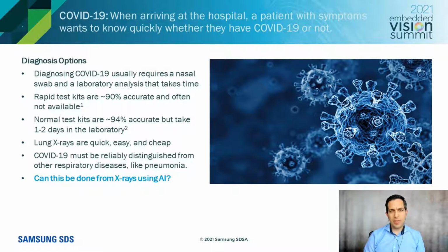And so the question is, can we, in an acute patient, detect COVID based on a lung X-ray? And of course, the answer is yes, otherwise I wouldn't be here today. So we're going to talk about how to actually make that happen.